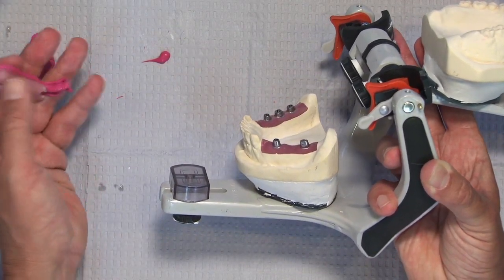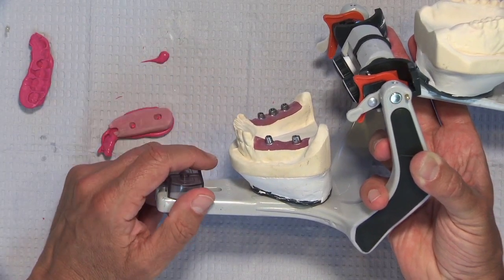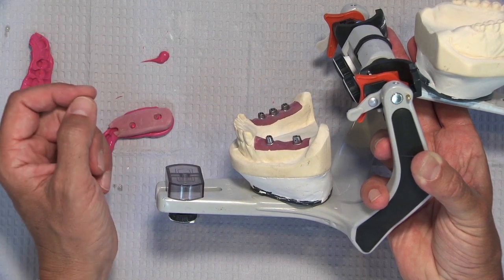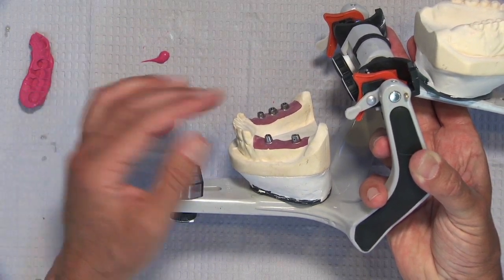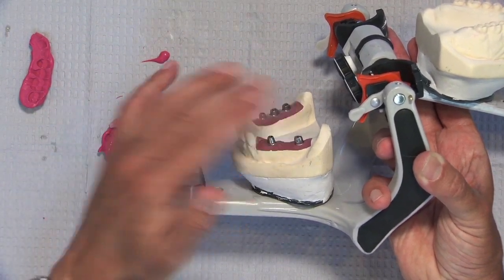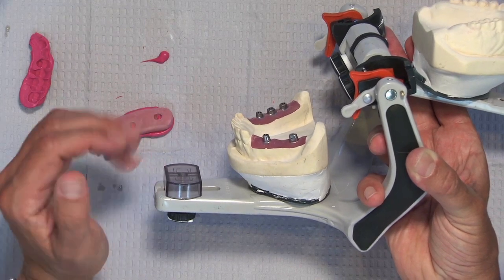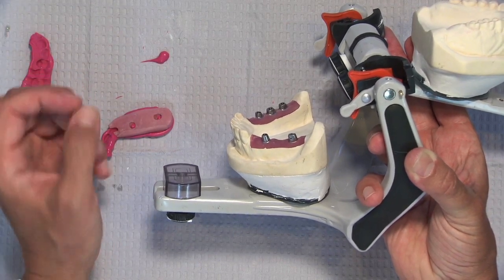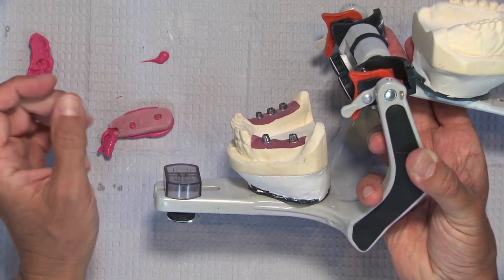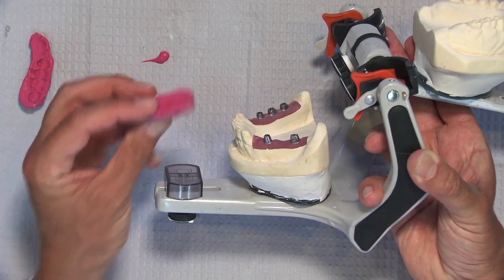But again, I'm not saying this because I'm at the laboratory, but I just like custom abutments because I want my laboratory technicians designing abutments with the ideal amount of draw, with the ideal taper, and the ideal amount of support for whatever permanent bridge, like a Bruxer bridge, is going to go in a spot like this. That's really one of the reasons why I prefer to use the custom abutments rather than using a stock abutment and prepping it myself in the mouth and then trying to accurately communicate where those abutments are going to be to the laboratory.